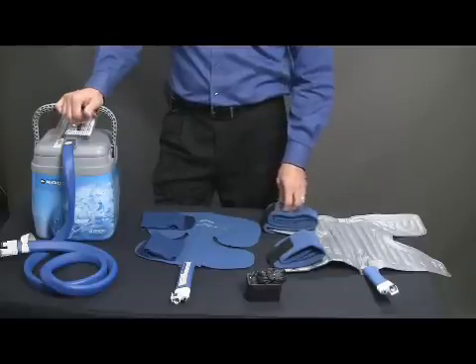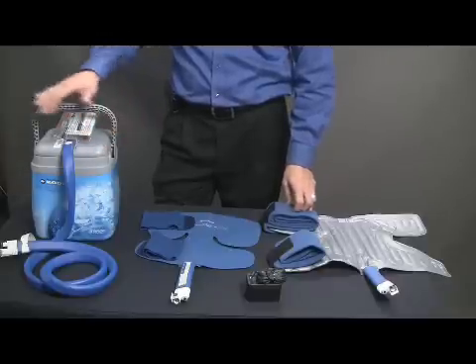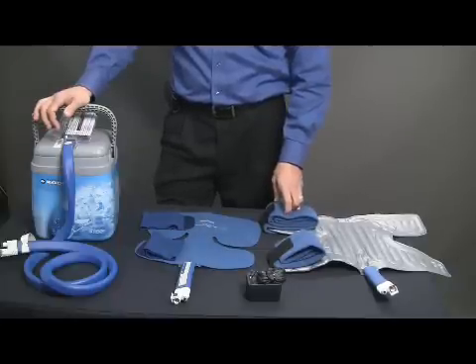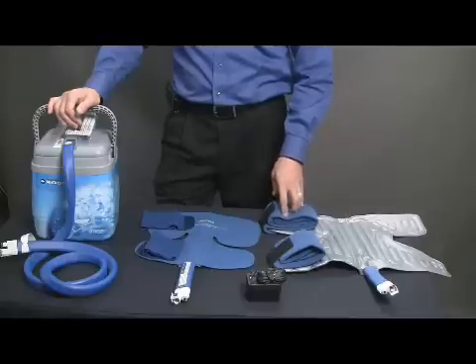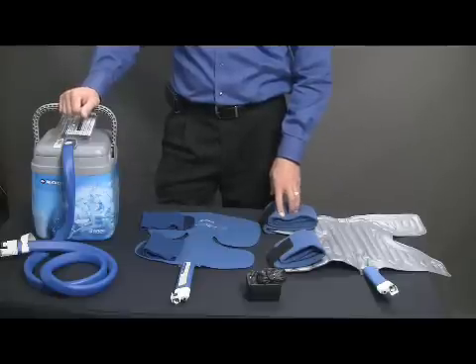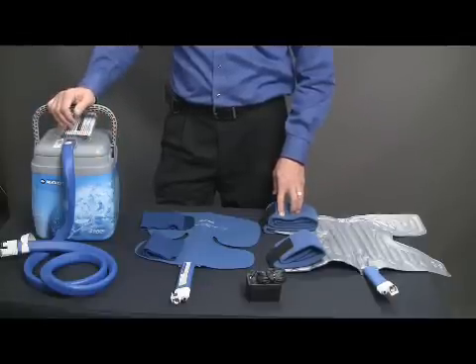We do need to talk about some contraindications and risk factors pertaining to any cold therapy device that's on the market. Some contraindications might include a history of cold injury or frostbite, patients that are incoherent due to general anesthesia or sedation, compromised local circulation or wound healing, circulatory syndromes, tissue infection, or diabetic polyneuropathy. And those are just contraindications for continuous cold therapy.